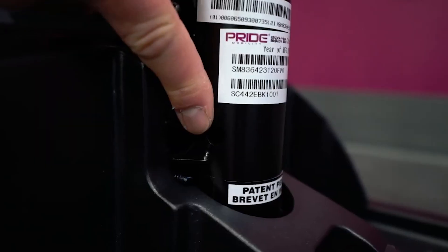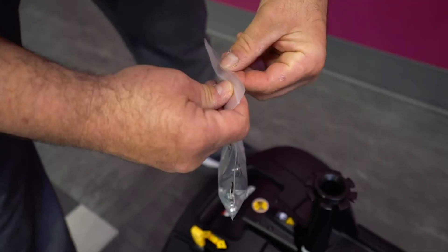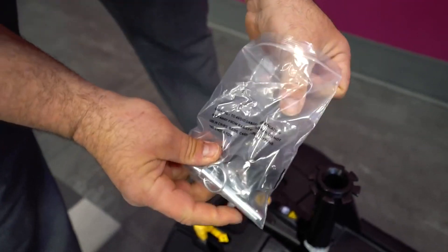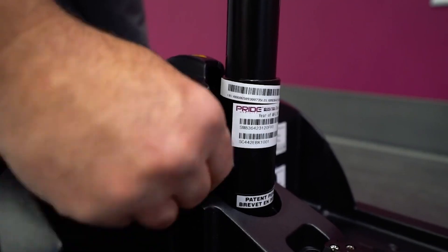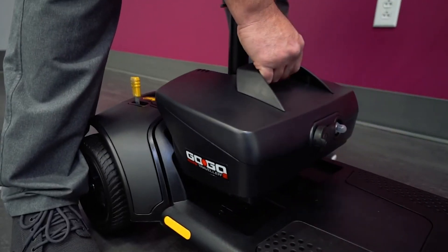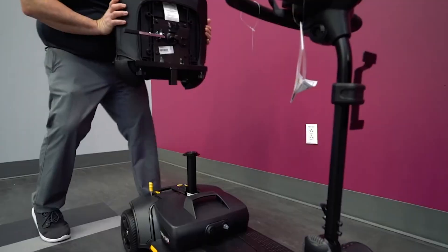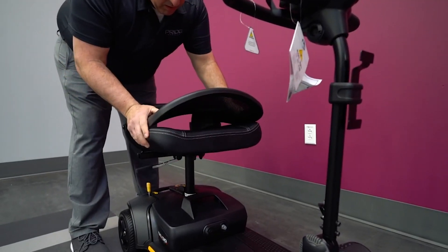Next, take the seat post and insert into the base. Use a pin fastener to secure the post in place. Take the battery pack and secure it in place around the seat post. Then take the seat, align it properly, and insert it into the seat post.